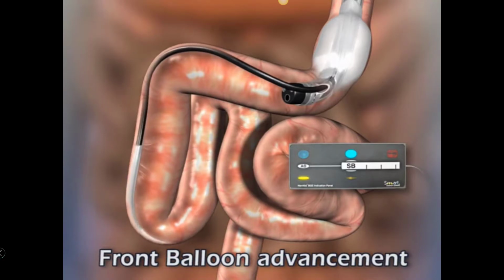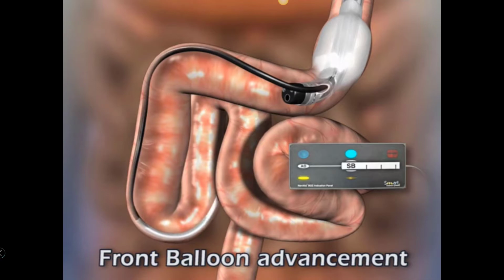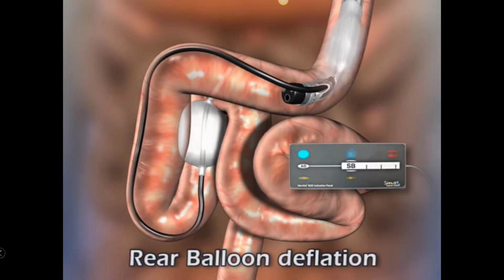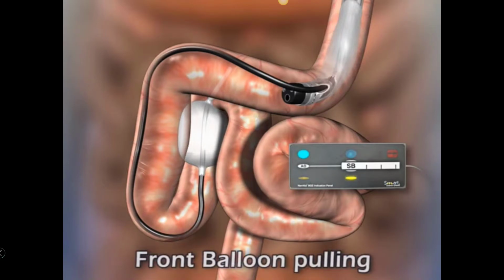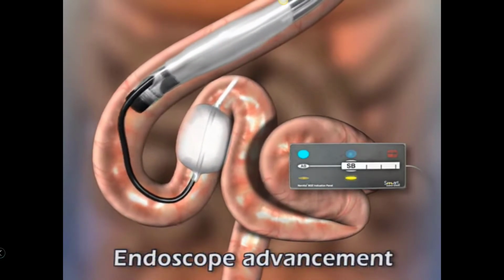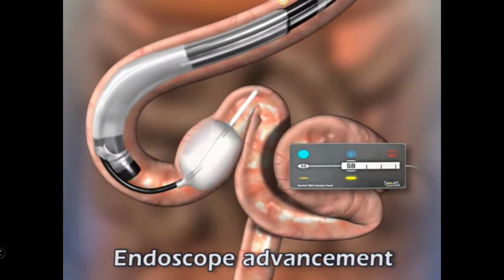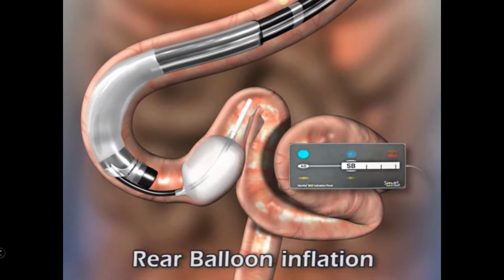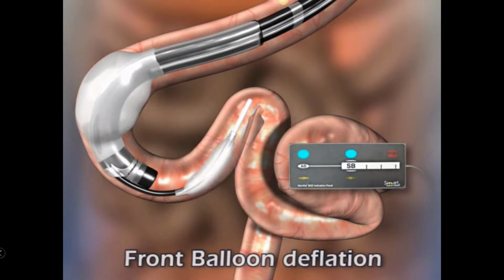Then the deflated front balloon is advanced ahead of the endoscope and inflated to anchor it to the intestine. The rear balloon is then deflated and the anchored front balloon is pulled while the endoscope is pushed through. As the endoscope reaches the front balloon, the rear balloon is inflated and the front balloon deflated.